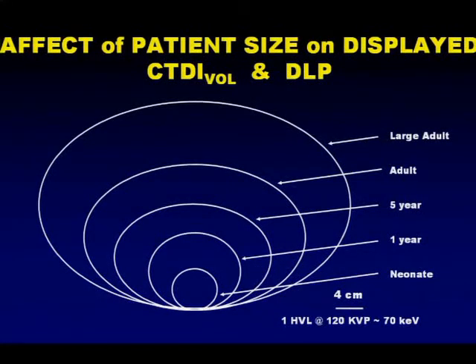Now, what about the fact that when we're dealing with pediatrics, we're dealing with a large variation in size of patient? How large a variation is that really? Well, if you're working in an adult institution, you have too much experience already with large patients and obese patients. The neonate can be as small as 4 to 5 centimeters in diameter. And of course, the neonate's going to be barrel-chested, so they're round. They don't have an ellipsoid shape. I've drawn it here in this diagram as 6 centimeters. A 7-month to 7.5-month neonate is going to be about 6 centimeters in size.